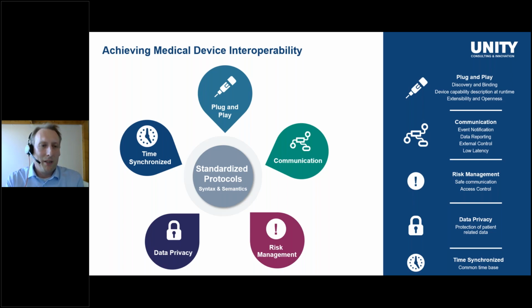As we develop a medical device, we also have to address the topic of risk management. That is for sure. This may include something like: how do we allow safe remote control? What do we need to consider? What might be preconditions for our device A so that it's actually allowed to control a ventilator? And of course, there's always the topic of data privacy and all the other aspects of cybersecurity.